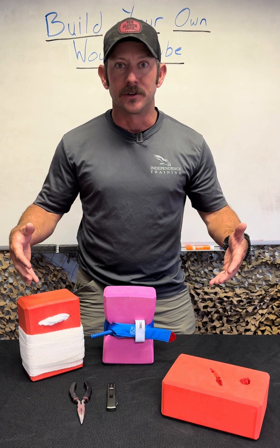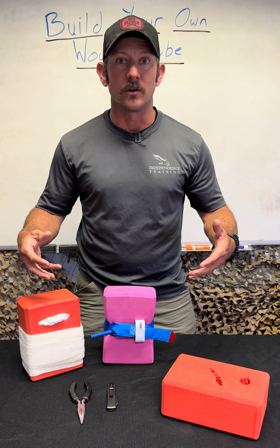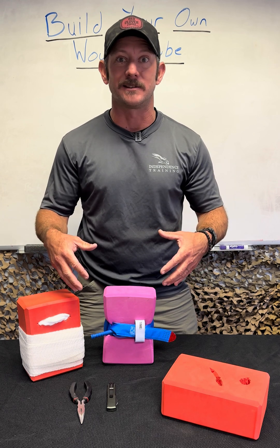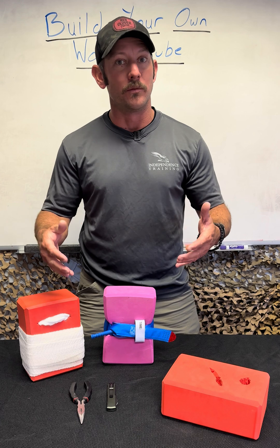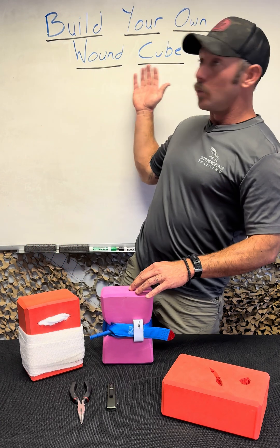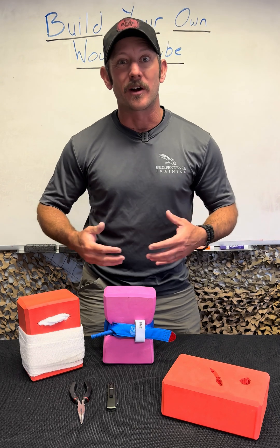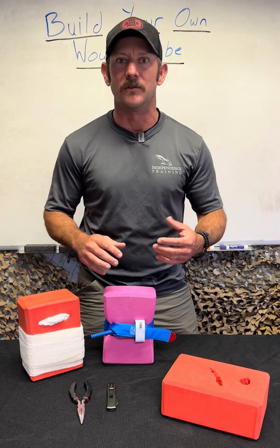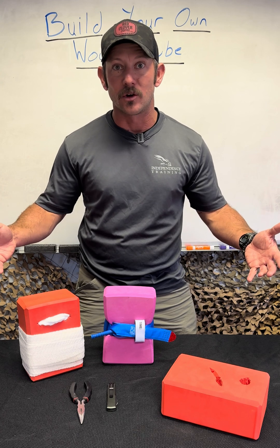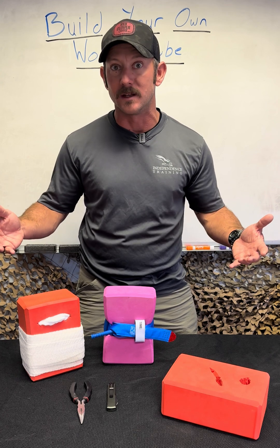One of the big parts of having any medical skills, and certainly after you take one of our training courses, is going to be to practice those skill sets. One of the easiest ways to practice things like tourniquet application and wound packing or general stop-the-bleed concepts is to have some kind of wound cube. But you want to make your own — a lot of the commercial ones are kind of expensive and a little bit limited on what you can do with them. So we like to show these off to our students in training courses, and I want to show you how to make one today.